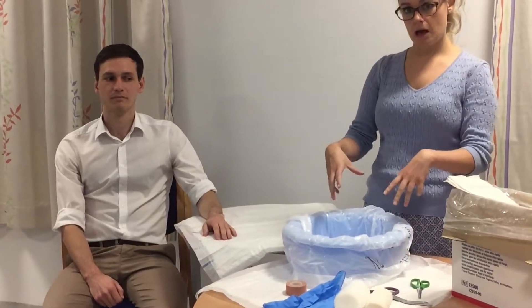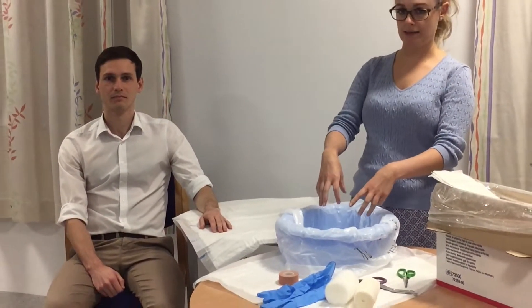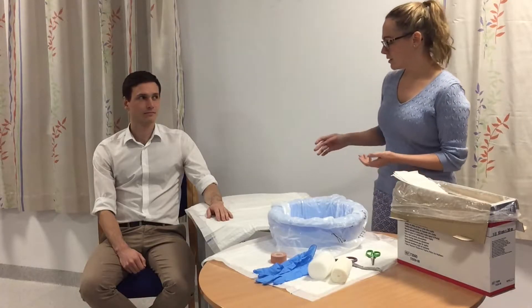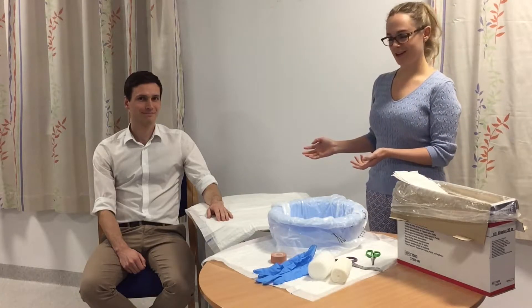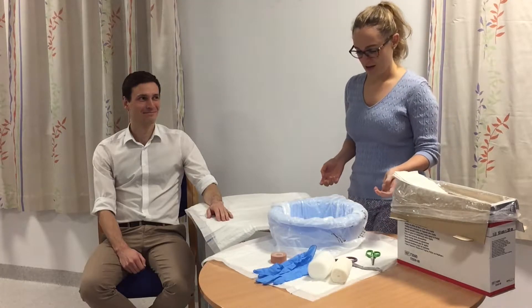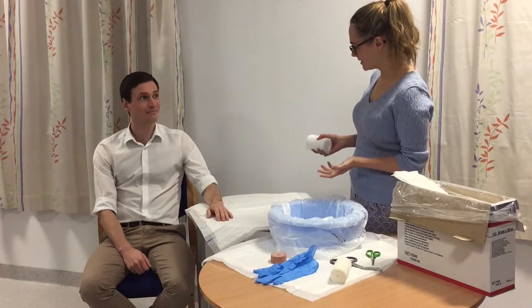We have a tub here with a bin liner in it, just to keep the water and the plaster contained, and some warm water — not too hot but not cold either. We have Lucas here, one of my colleagues, who is going to be our patient.